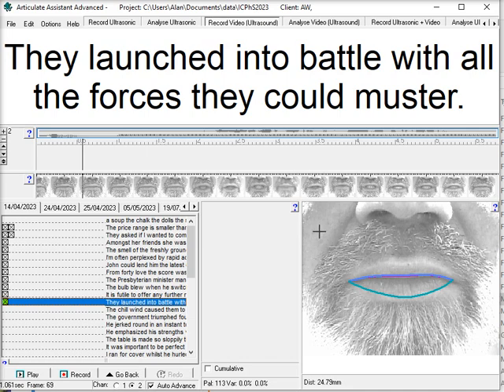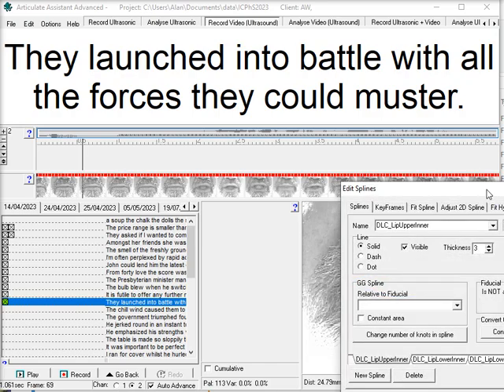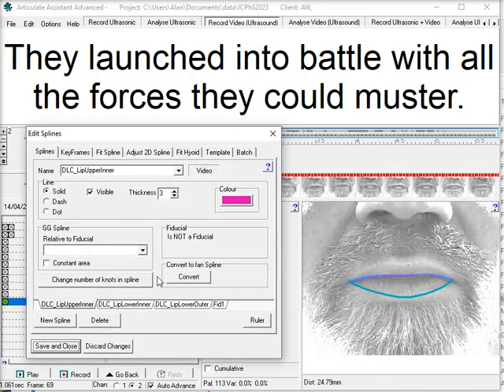So the next thing you have to do is to open the Edit Splines dialog. So if you right click on the video and click Edit Splines, we get the dialog, and we will select one of the lip splines. Here we've got a DLC lip upper inner, and we'll select the first tab, splines, and you'll see in the bottom right hand corner this button called ruler, and this is how we're going to do the scaling.